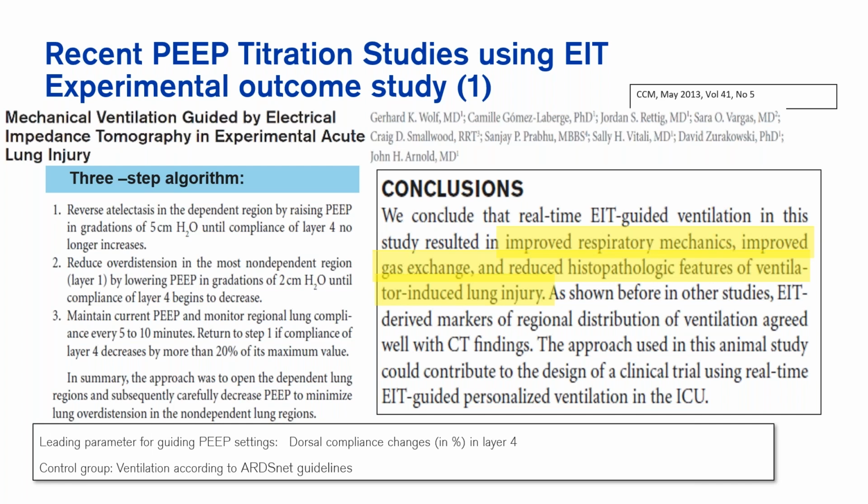So basically, EIT-guided PEEP settings resulted in more lung protective, individualized ventilation settings in the animal models.